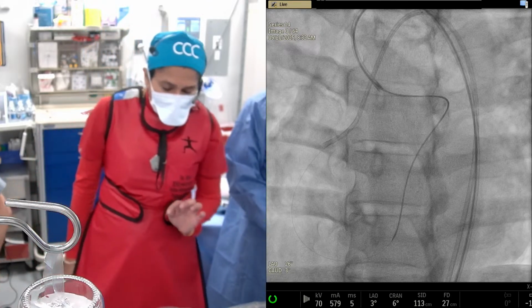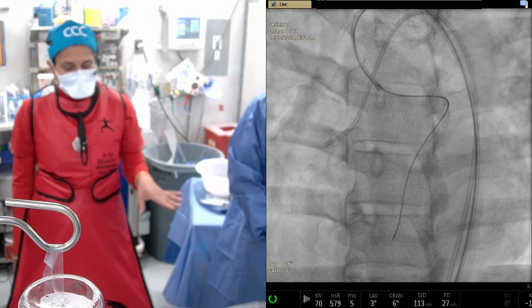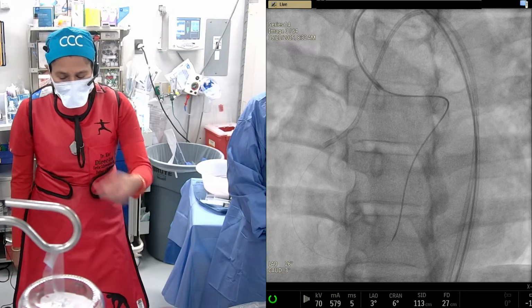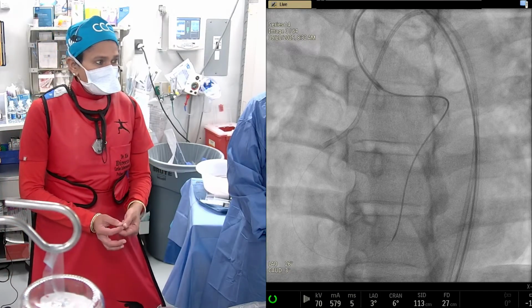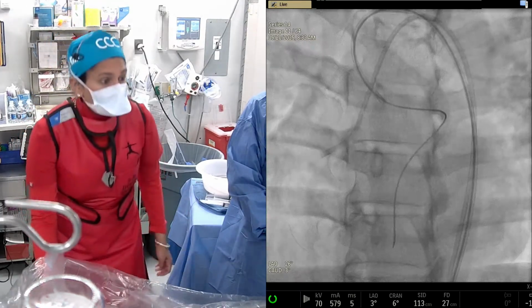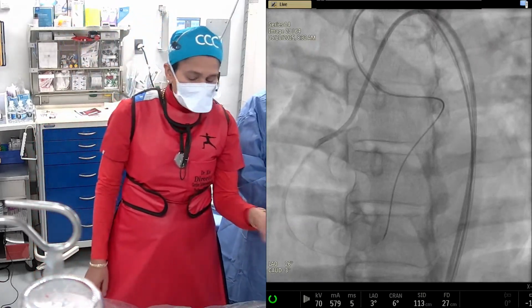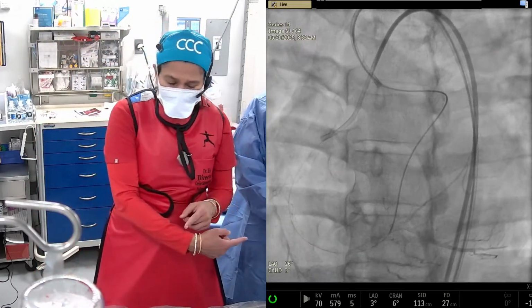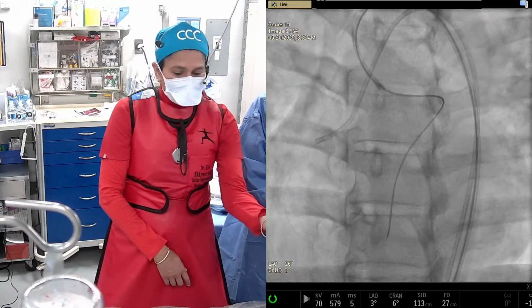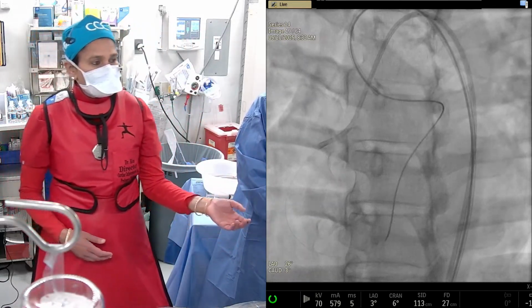Now at that point, what we did last time, retrograde, and what we did this time was different. Last time, as soon as we came out of the contralateral, we went with a FineCross from the contralateral, and then we removed that wire. But here, we dilated on that wire to show a different step. We dilated on the RG3 wire. We showed that the flow is very good. Then you can go side by side with any 300 workhorse wire, and you're finished.